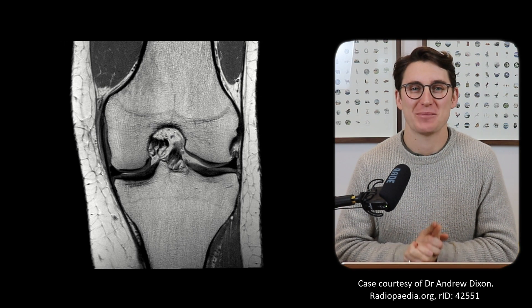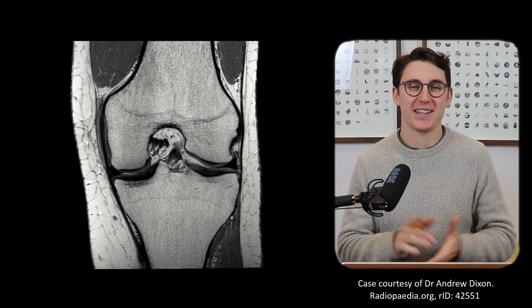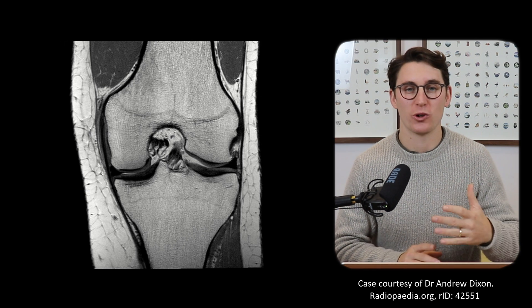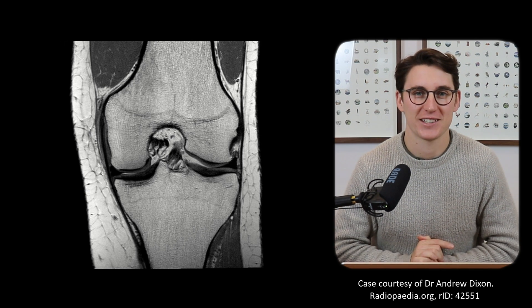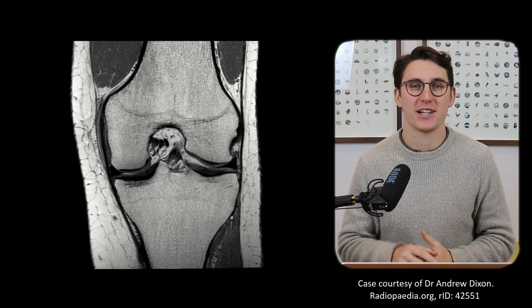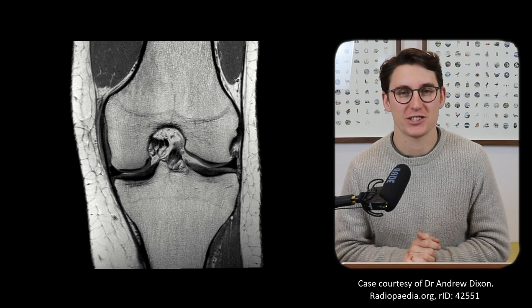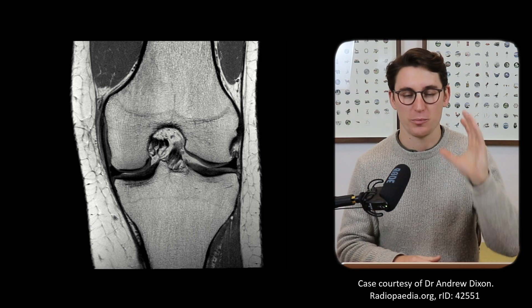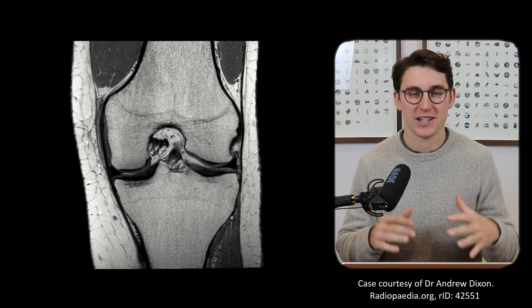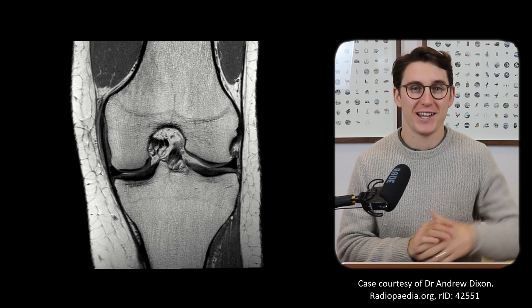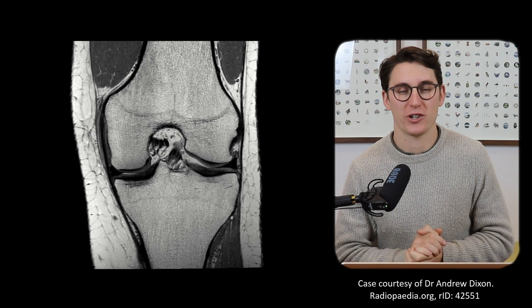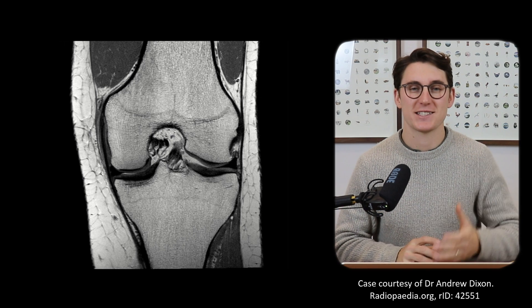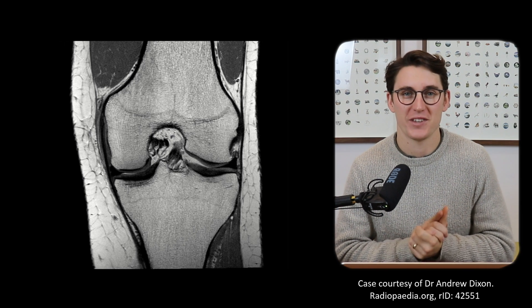Hello everybody and welcome back to another anatomy tutorial. Today we're going to be looking at the anatomy of the knee, specifically the MRI anatomy in the coronal, sagittal and axial planes. I'm going to show you how to identify some really clinically important structures and then head through each scan in a systematic way, looking at the bones, the ligaments, the menisci, the articular cartilages, some of the muscles that cross the knee joint, the fat pads surrounding the knee joint, as well as assessing the extensor mechanism of the knee.